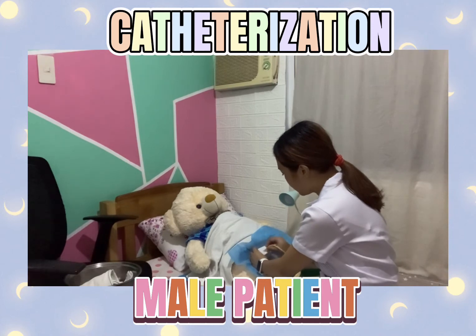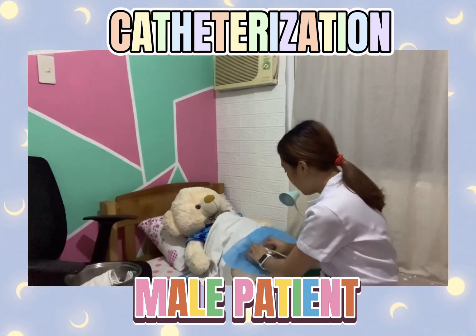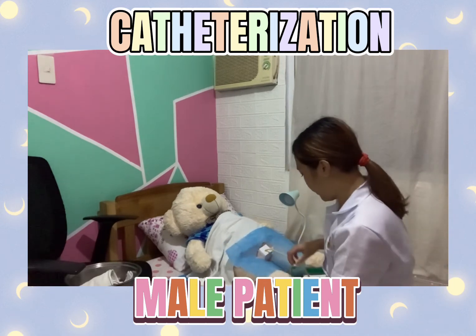Make sure not to use forceps in inserting the catheter. And then, if resistance is present, make sure to rotate the catheter. Resistance is not present on our patient.